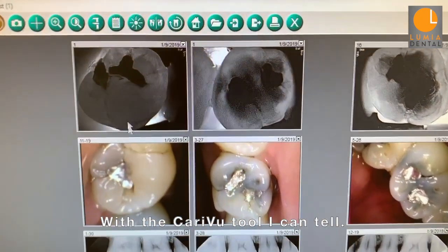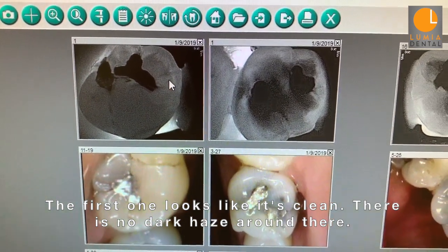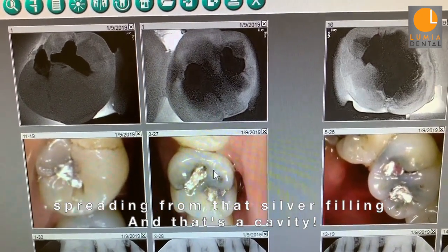With the CariVu tool, I can tell. The first one looks like it's clean — there's no dark haze around there. The one next to it, however, it almost looks like a rash spreading from that silver filling, and that's a cavity.